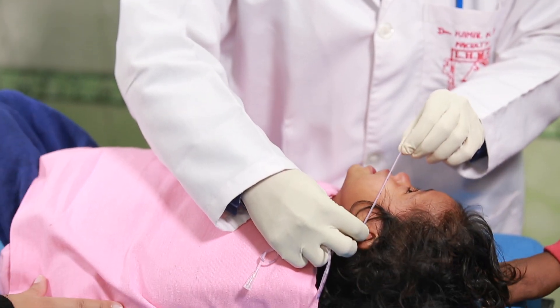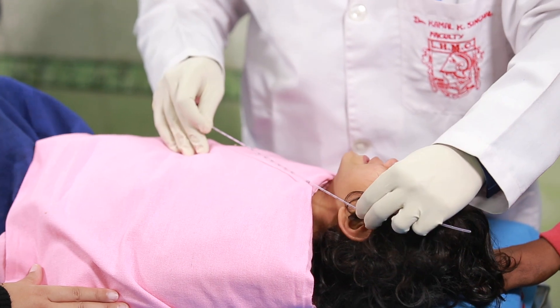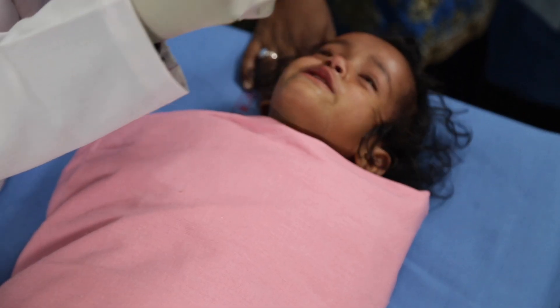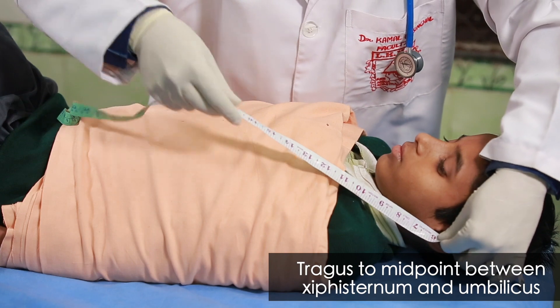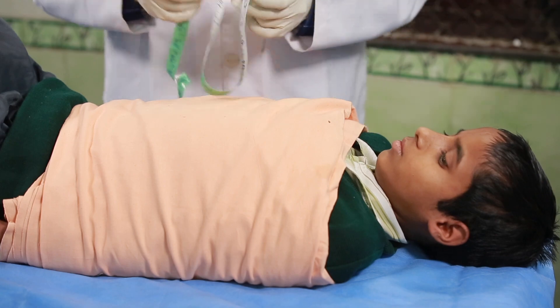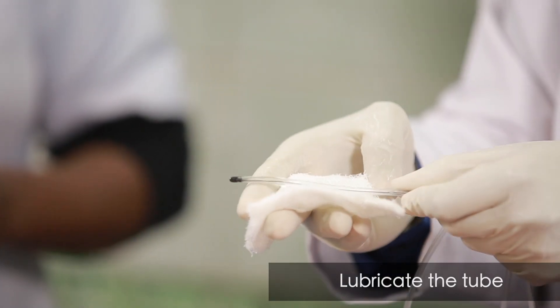The riles tube needs to be placed in the body of the stomach through the nose. The required length of tube to be inserted can be ascertained by measuring the distance from the tip of the nose to the tragus, and then from the tragus to the midpoint between the xiphisternum and umbilicus. Apply lubricant jelly to the tube.